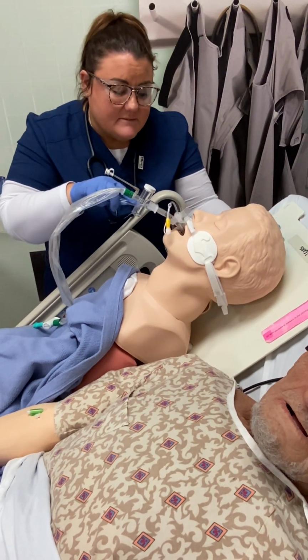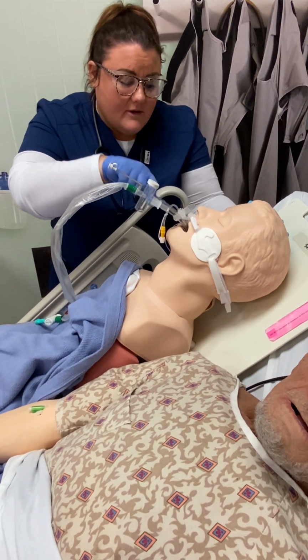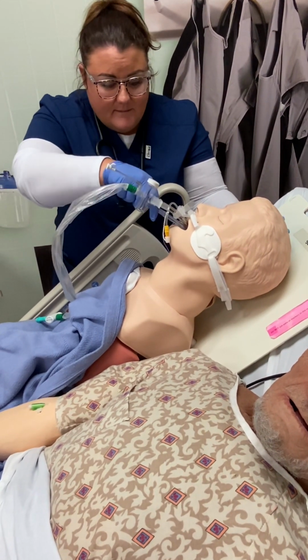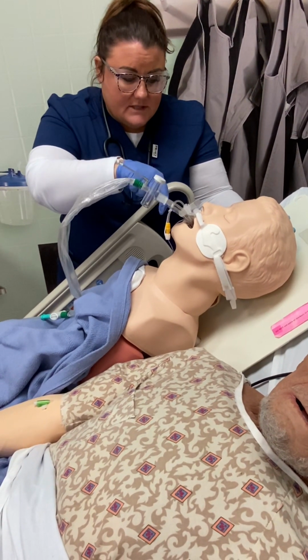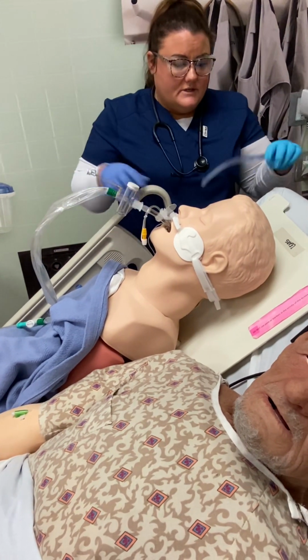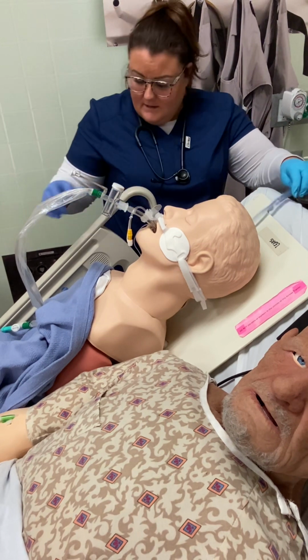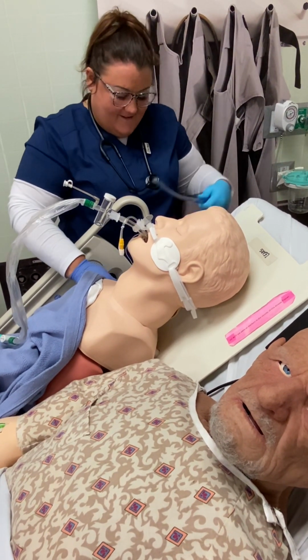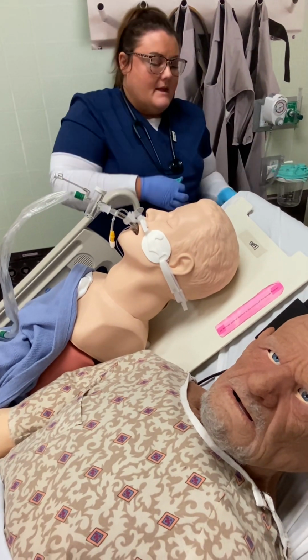Okay, Mr. Smith, I'm just gonna suction out your mouth. Get in the back of his throat, the sides of his cheeks, making sure that we get any secretions. Good job. Okay, pull the sheath back down. Just place this here. Not really working. Okay. All right.